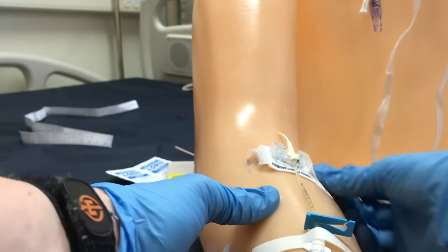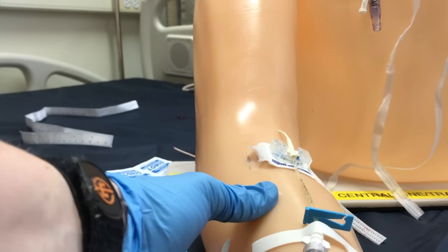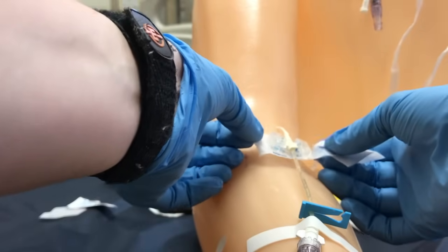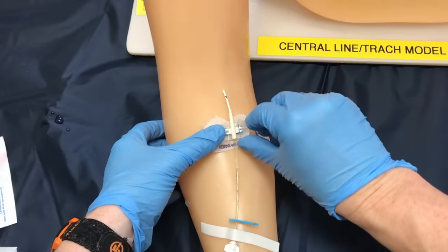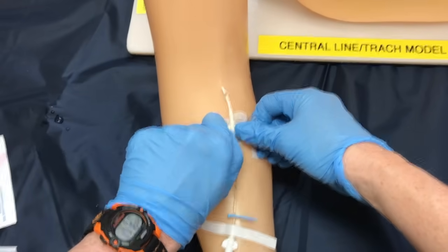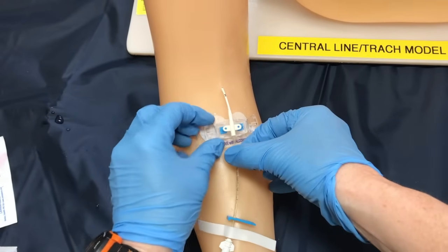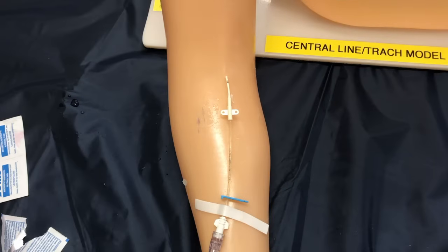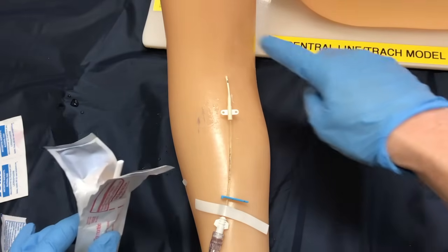Now we need to do the other side. Now that we have this all loose and it's able to leave the skin, we're going to open the clamps, lift our line up, and remove our dressing. At this point we need to clean it. We can still use our clean gloves, or you can choose to put on your sterile gloves at this time if you've put your content in your sterile dressing. I'm still using a clean procedure and I'm now going to do my cleaning.